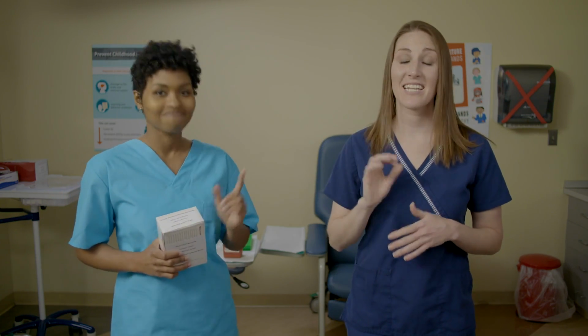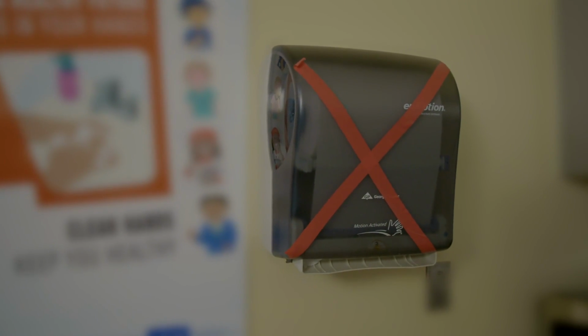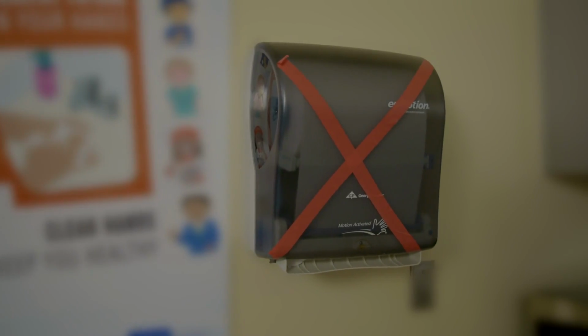Some paper towels are made from recycled materials that can contain trace metals. So, if you dry your hands with them, or dry the patient's hands with them, or they touch anything that's going to come in contact with blood collection devices or the blood sample itself, they can cause contamination. So steer clear of paper towels when drawing blood to test for lead. But really, no need to do this. Just remember, paper towels equal possible contamination.